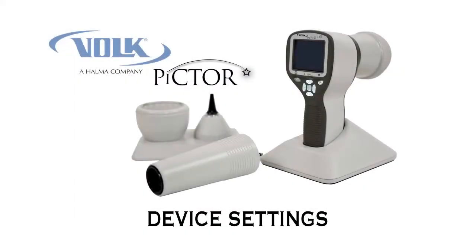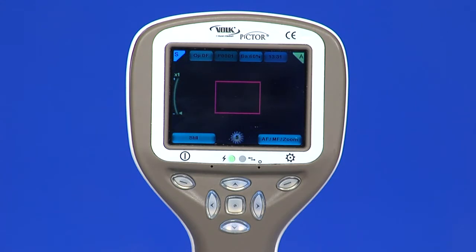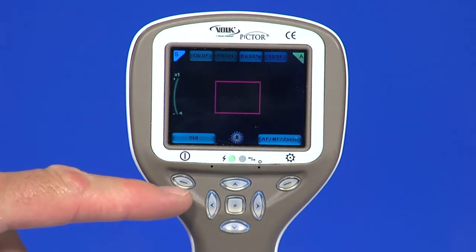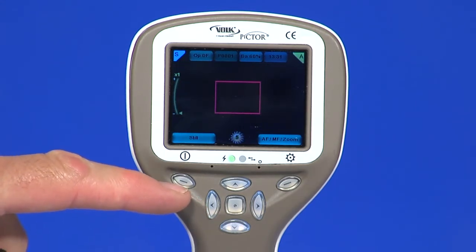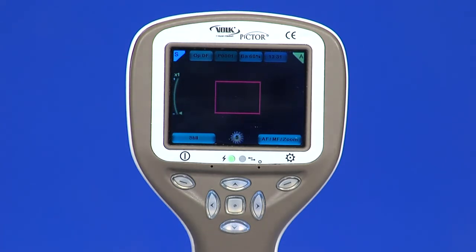Let's run through the screen icons. At the top left, S indicates still shots, V indicates video mode. These modes can be changed by pressing the left soft key. OPDF indicates that general imaging is in use. This would automatically change should a module be attached.